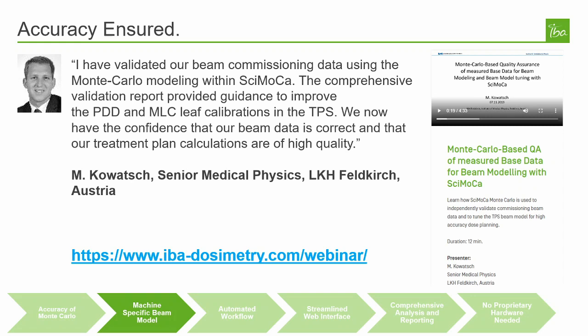I also have some comments addressing the accuracy of SciMoCa from Matthias Kovich, head of the Radiotherapy Physics Group at LKH Feldkirch, Austria. He said the following: I have validated our beam commissioning data using the Monte Carlo modeling within SciMoCa. The comprehensive validation report provided guidance to improve the PDD and MLC leaf calibrations in the treatment planning system.